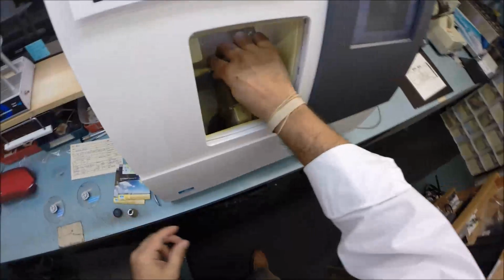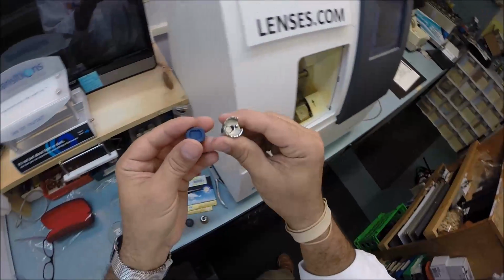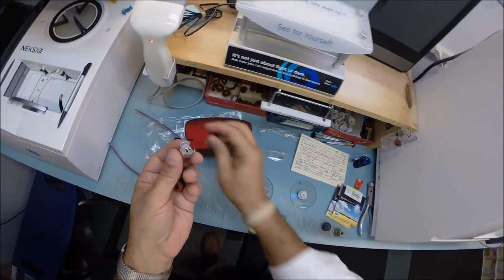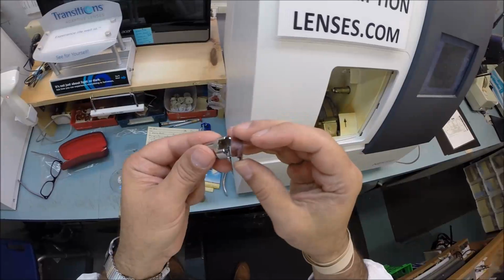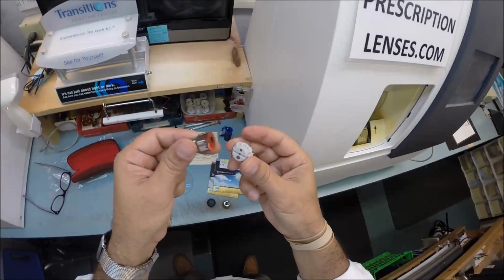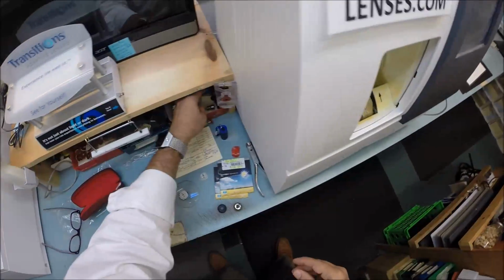So it comes in 2 sizes. The last one I cut was an itty bitty little lens. It goes into a very small frame. So those come off. That's what these little red ones are for. You see these occasionally in my videos, but we're going with the white ones, the larger ones that go in this size.